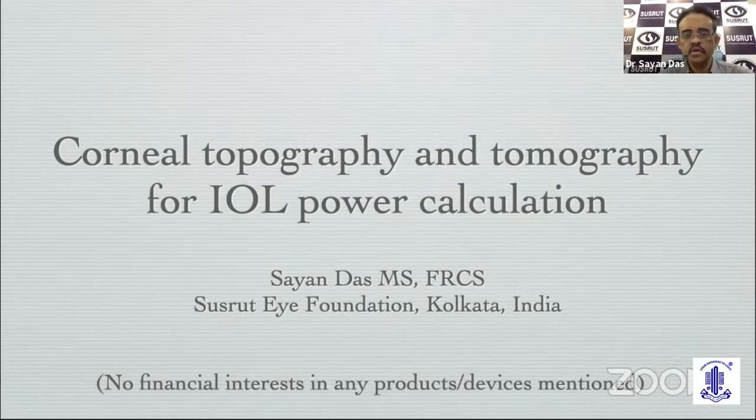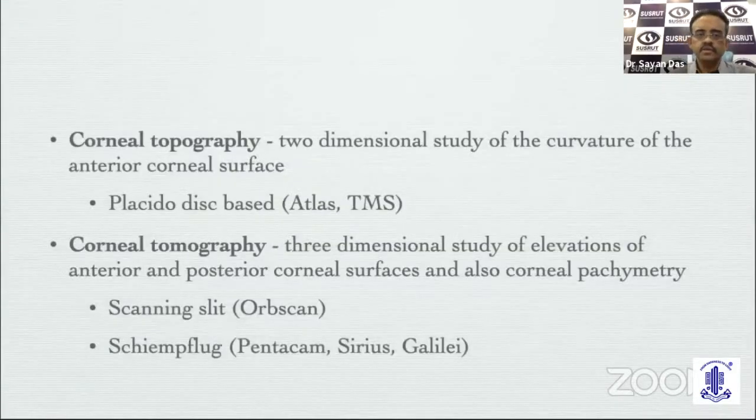I'll be speaking on corneal topography and tomography for IOL power calculation. So, as we know, corneal topography is a two-dimensional study of the curvature of the anterior corneal surface, and the devices we use for topography are usually placido-disc-based.